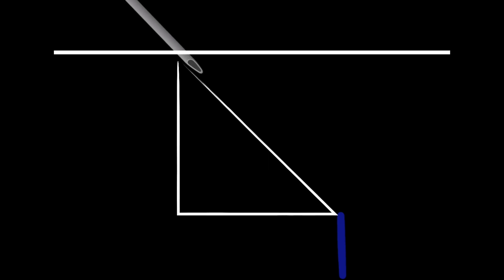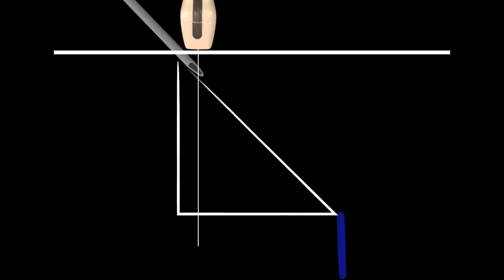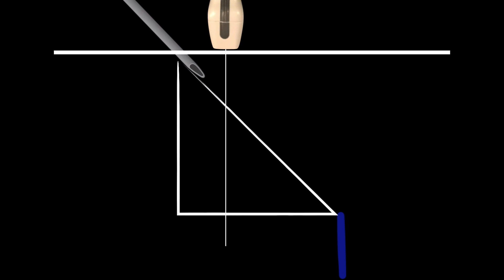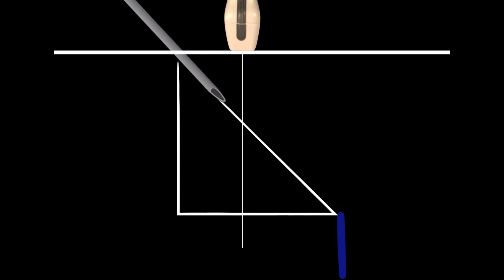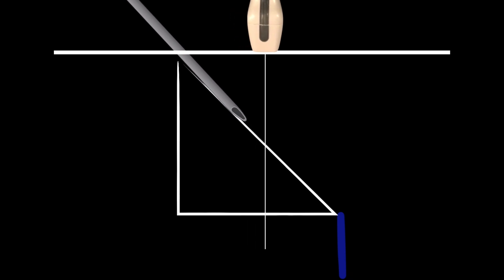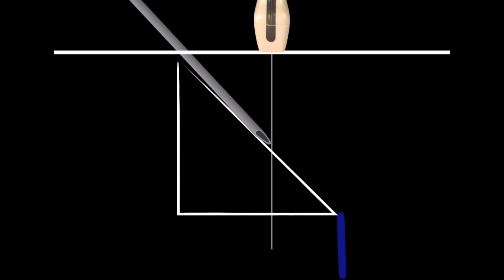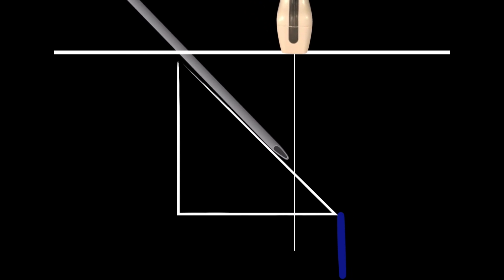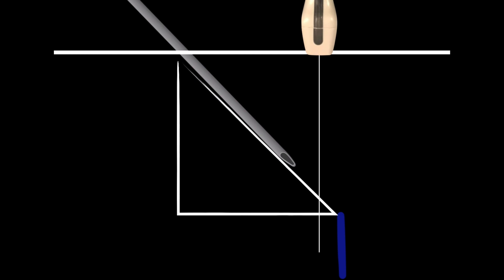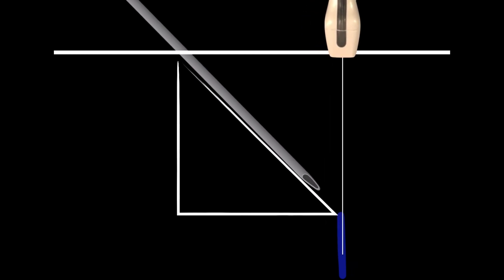We put the needle under, then take the probe back to find the needle tip, and then advance the probe first. After advancing the probe, advance the needle until we see it come into view. Once the needle tip comes into view, stop moving the needle and move forward with the probe. I do this typically every two to three millimeters depending on depth. Once we're sitting right on top of the vessel — we'll see what's called tenting — drop the plane of the needle just a little bit, maybe to 20 to 30 degrees, then enter the vessel to try not to go through the posterior wall.